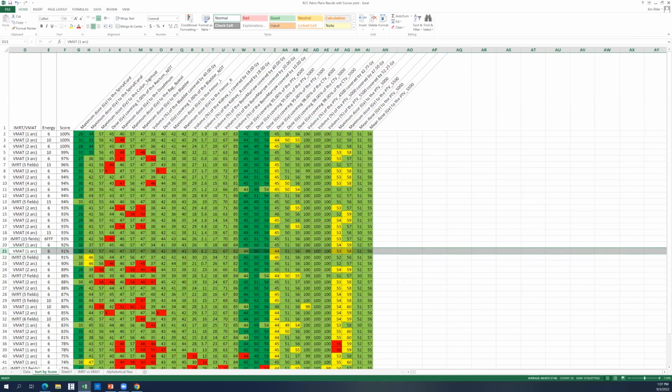Olga says that it depends on the density of the margins. We're not Monaco users. The concept is probably similar in Eclipse to some extent. How does it work in Eclipse? Again, we don't do IMRT breasts with Eclipse, but it seems to me you would always want a flash. You would never want to close down your MLC to the edge of your surface.